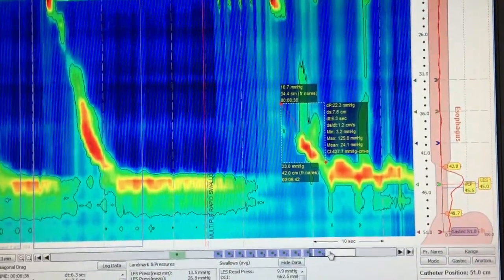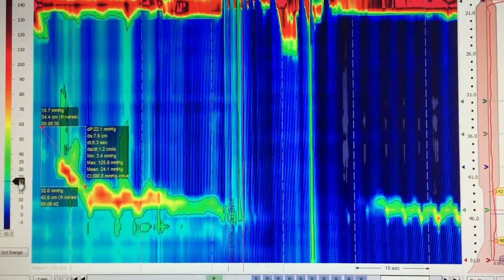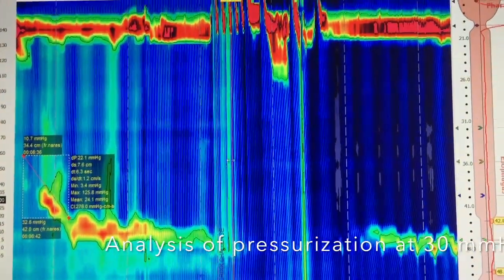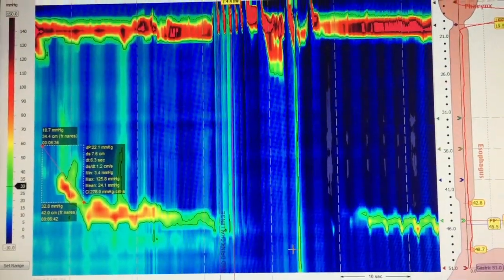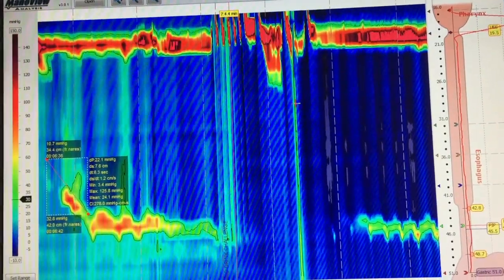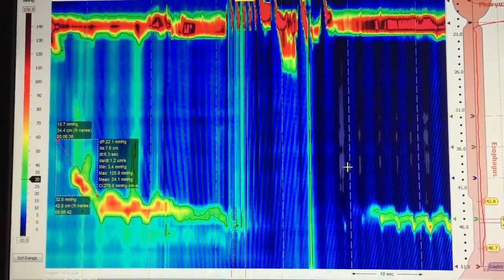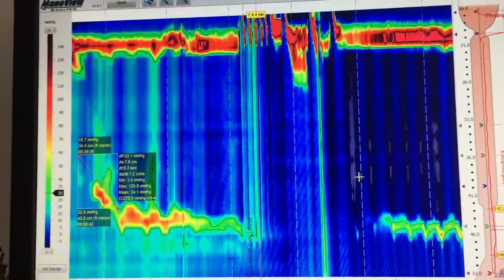I will look at the rapid drink challenge, which is here. I will look for pressurization — we look at a 30 mmHg isobaric contour. There is no abnormal pressurization. The only thing you can see is a slight increase of pressure, but it might be due to a cough in this patient. You can see that there is an EGJ relaxation. There is also no contraction after the rapid drink challenge test, which is not uncommon even in normal subjects.